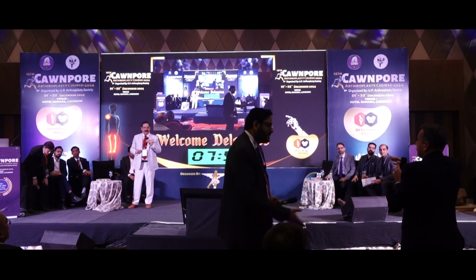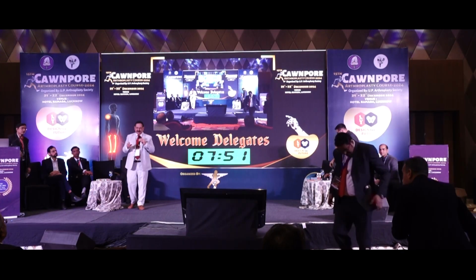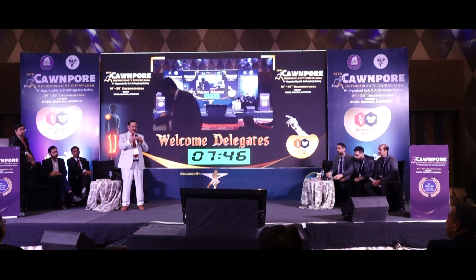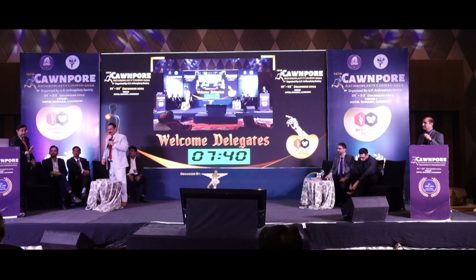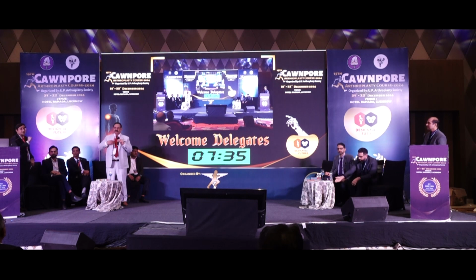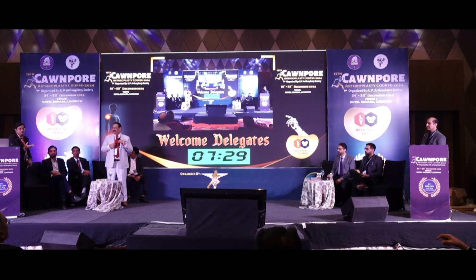If it is a contained defect, which graft is better, morcellized or chips, or what graft do you prefer? So the ideal size is 8 to 10 millimeter, not the reamings. 8 to 10 millimeter size is supposed to be the ideal for osseointegration. So this is a very important point. It should not be totally paste. It's not good. It has to be 8 to 10 mm. So they're little bigger grafts, and they have to be impacted very well, carefully, and then you have impaction sets now available. Indian ones are also available with which you impact that graft.